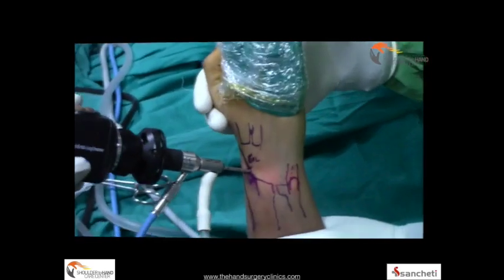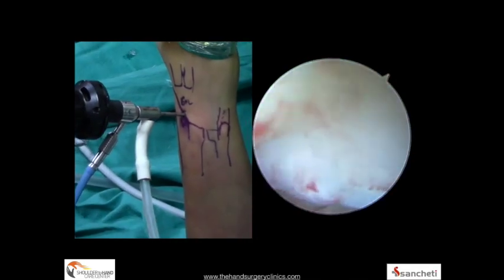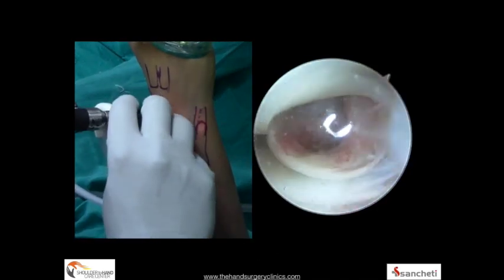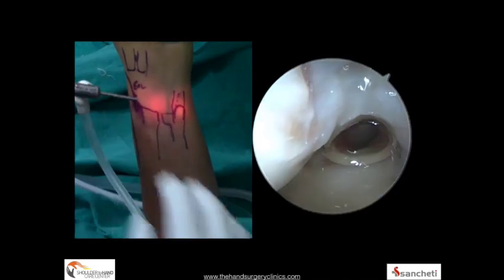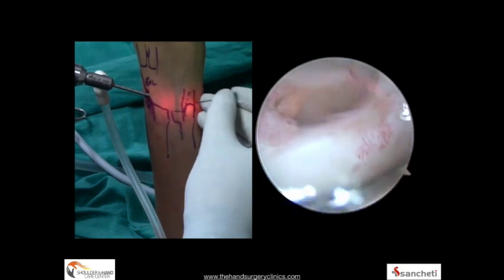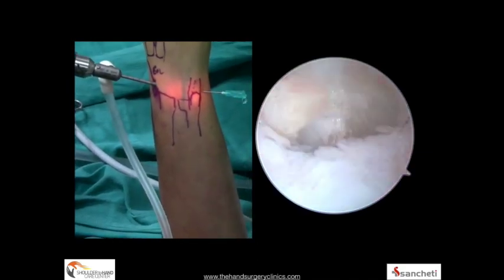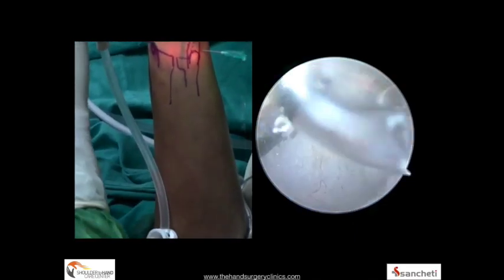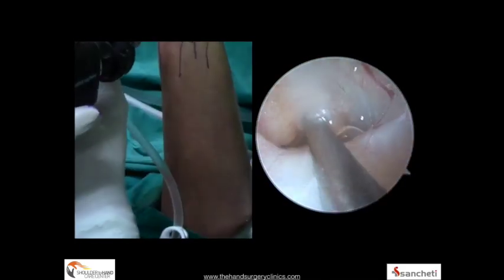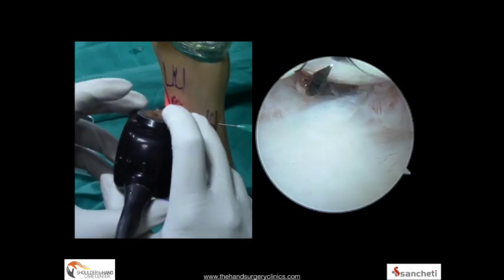The arthroscope is inserted through the cannula and locked, beginning the diagnostic survey of the wrist joint. It is my practice to follow a set sequence of observation: bone to ligaments, proximal to distal, radial to ulnar. Following this set sequence means it is very seldom that you will miss the pathology during arthroscopy. An outflow cannula is inserted into the 6U portal for egress of saline, which also marks that portal for potential instrumentation or suture anchor passage.